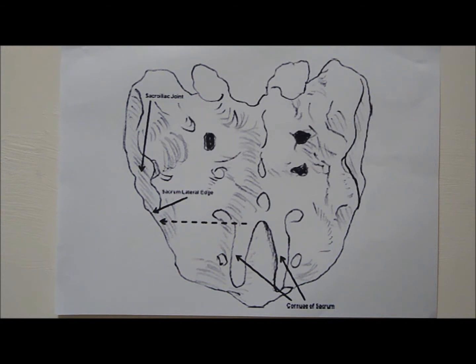Ladies and gentlemen, we will now demonstrate to you how ultrasound guided sacroiliac joint injection is performed.